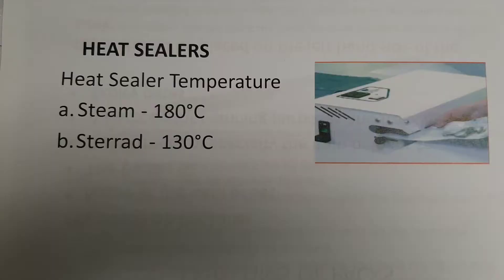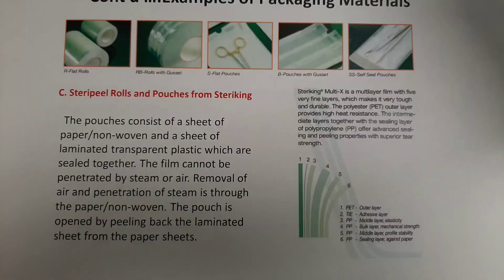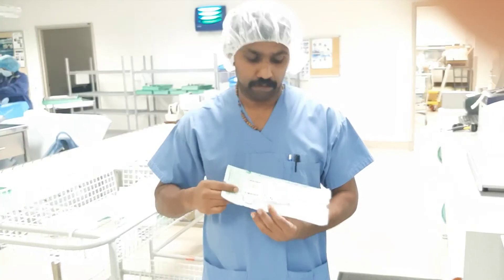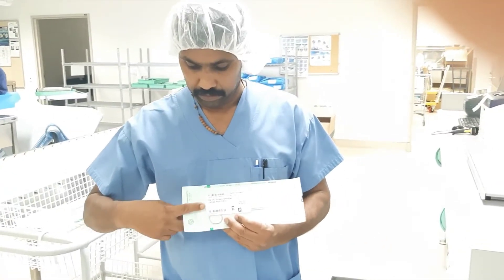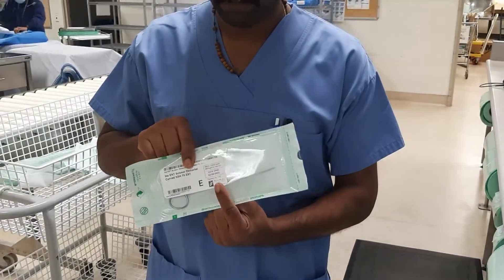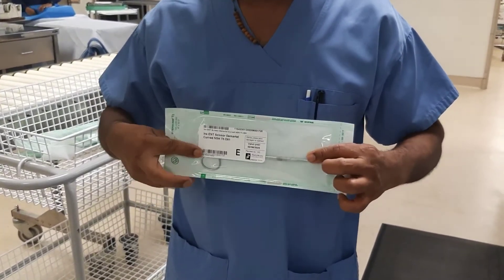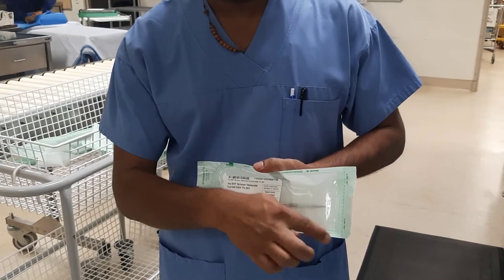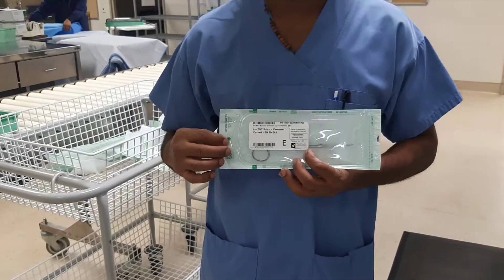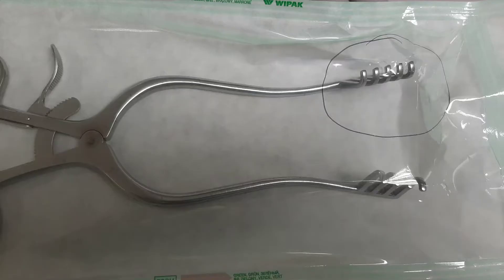After sealing the pouch, put a finger on the top of the pouch to make sure there is adequate room. If instruments are packed more than 75% of the pouch volume, we cannot assure safe sterilization agent penetration during sterilization. Similarly, if we pack instruments on top of each other, during sterilization the instruments may poke through the pouch and sterility cannot be maintained.